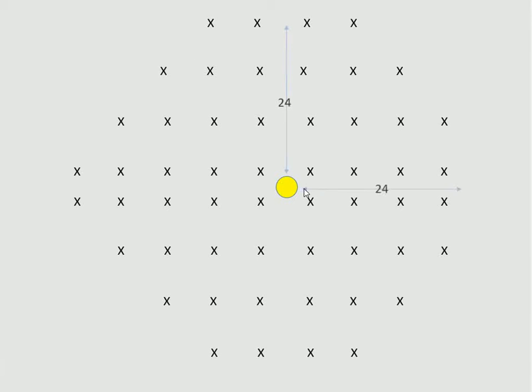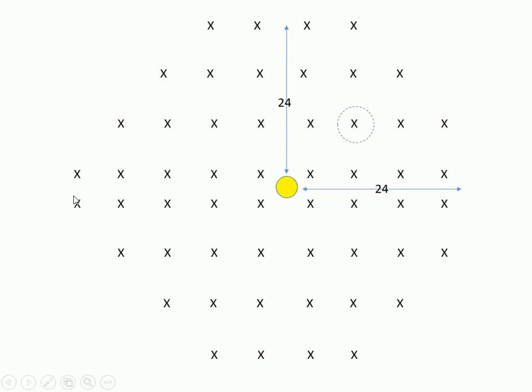Let's take an example. Just to show you that these points cover essentially 24 degrees each way, except in this case it's the right eye that's being tested, so on the nasal side it extends out to 30 degrees. Let's pretend now that the machine's going to try to establish how well the patient's peripheral vision is at this particular location.